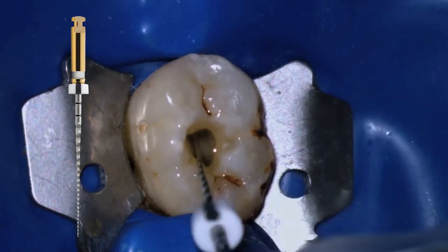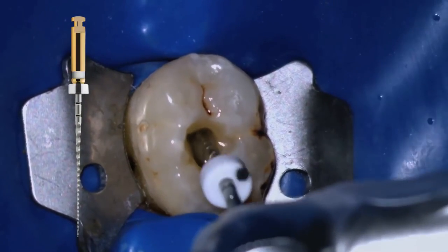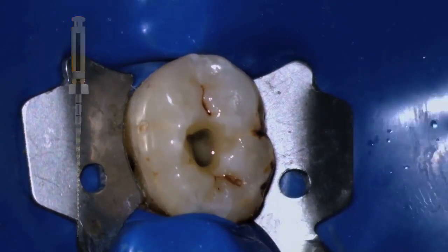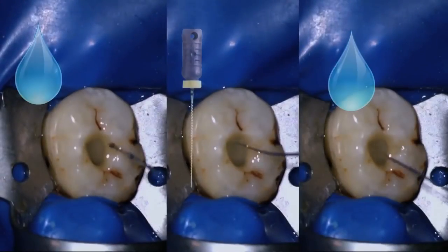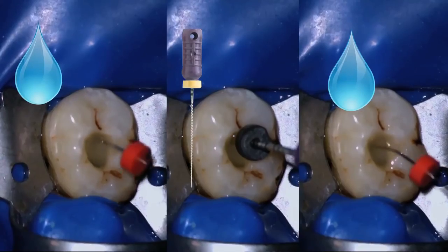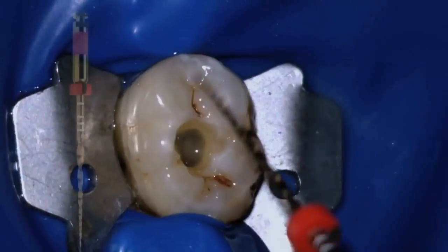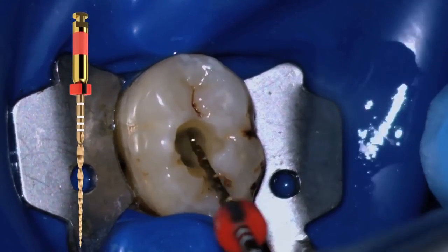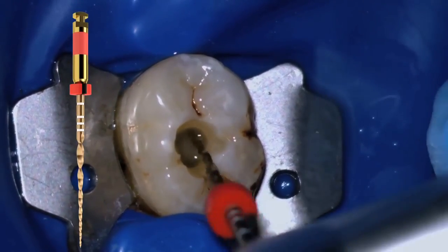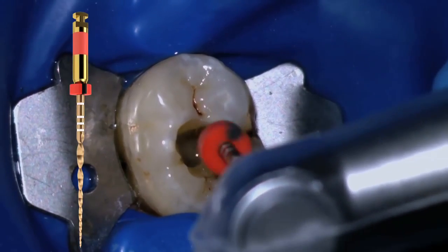As you can see here with the ProGlider rotary instrument, we are going little by little in amplitude strokes of 3 millimeters all the way to working length. Sometimes it takes several steps to achieve this length. And after that, we irrigate the canals. We verify that the canals are still patent. We make sure that we have not blocked ourselves.